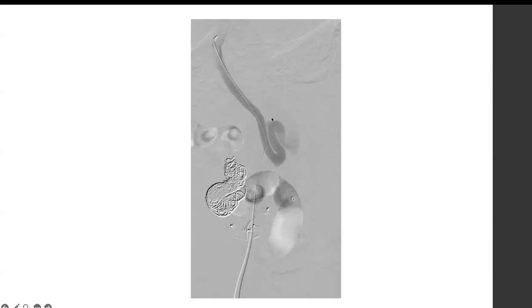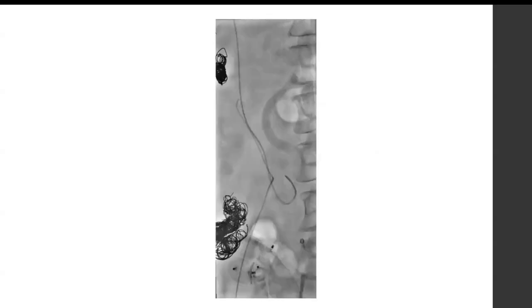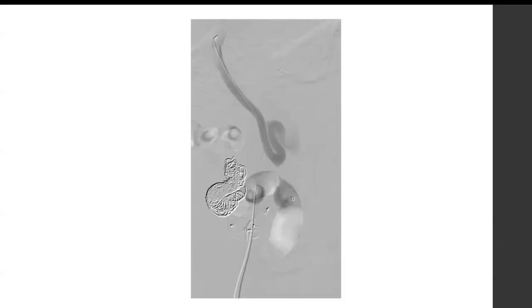Okay, well, the umbilical vein here is another shunt. So we can close that too. And it's helpful because we have an access into the umbilical vein. So we're in a pressurized system. We've made a hole into it so patients could theoretically have bled from this. So you want to close your access. You don't just pull everything out.